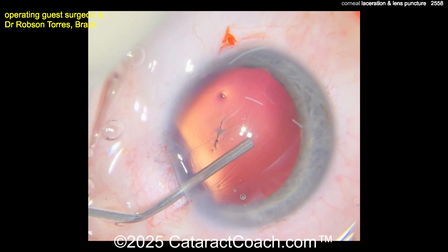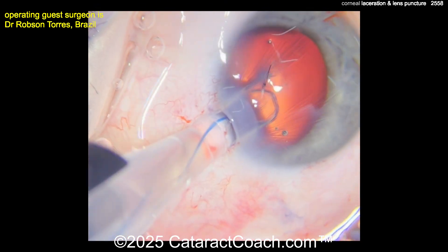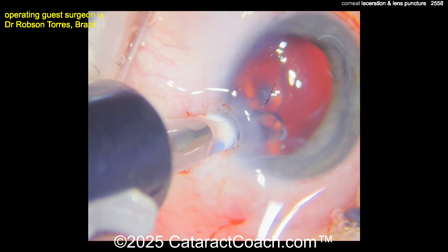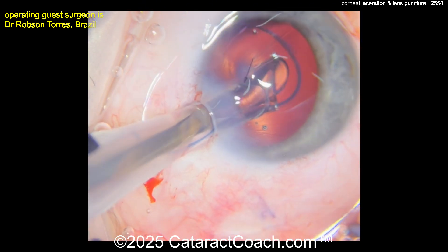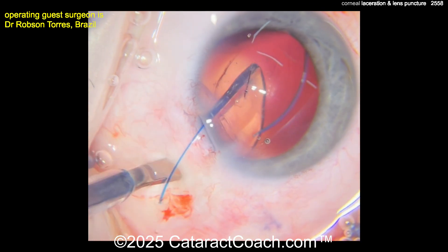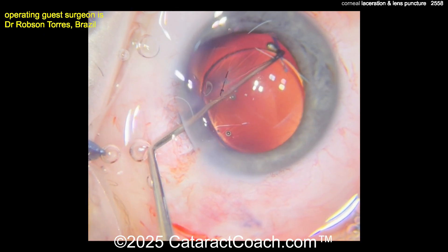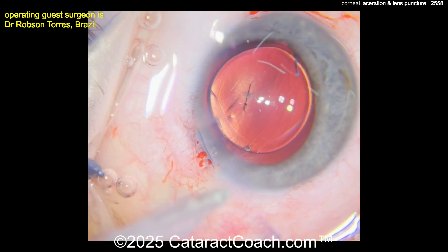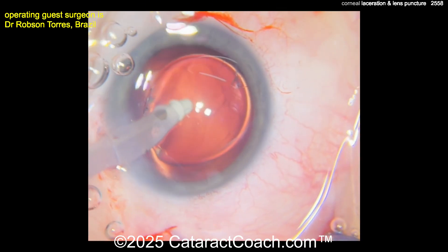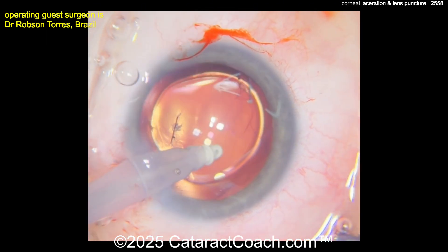Cleaning all this up and adding more viscoelastic — let's get the lens in the bag. I also like this incision. A three-piece lens gives more options. Remember the 7-L rule: the leading haptic comes out like the number seven, the optic opens up inside the eye, and the trailing haptic looks like the capital letter L — so overall it's the anti-S. An S configuration would be a stupid mistake we don't want to make.